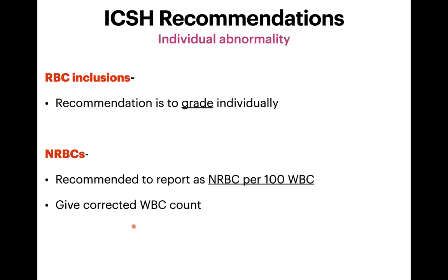And then RBC inclusions, again, grade them individually. That is the recommendation. In case of NRBCs, it is recommended to report them as NRBC per 100 WBC and always give a corrected WBC count.